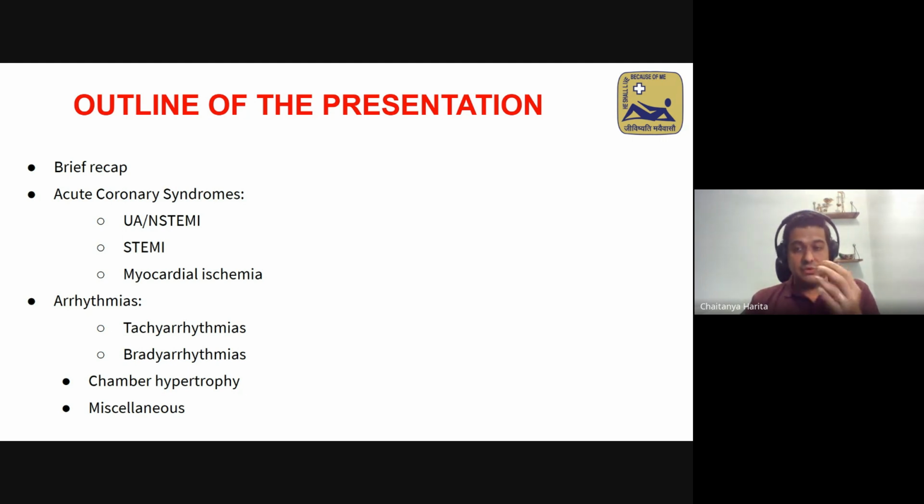Today's class will focus on two of the biggest challenges that all of you will face, or all of us face, which is diagnosing acute coronary syndromes and identifying arrhythmias. Chamber hypertrophy and miscellaneous I may not have time to touch upon, but definitely ACS and arrhythmias are the two most critical things that any doctor, irrespective of what field they're in, should know how to identify.